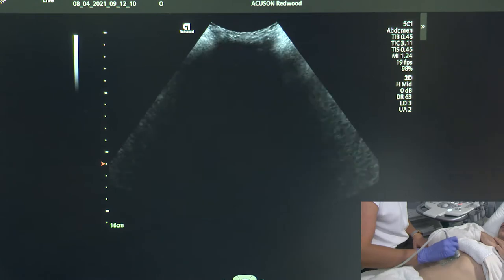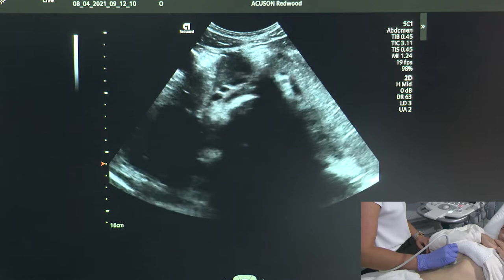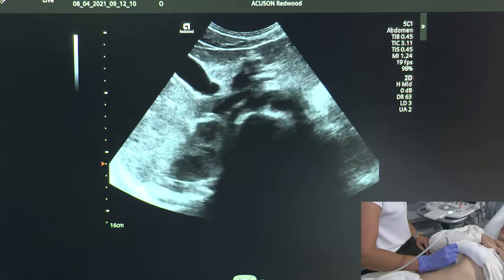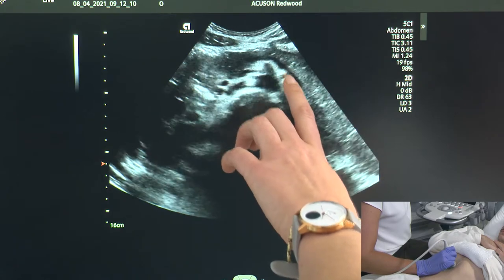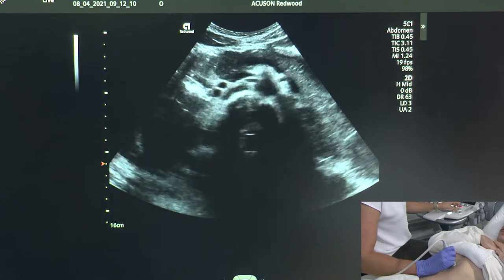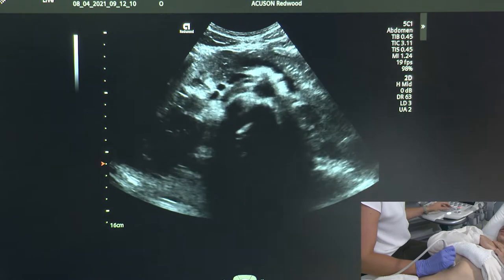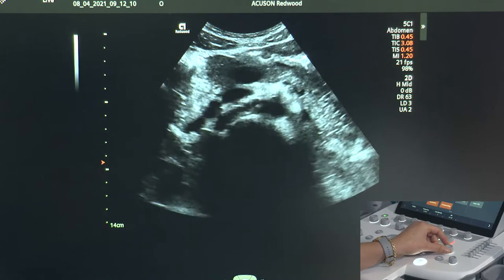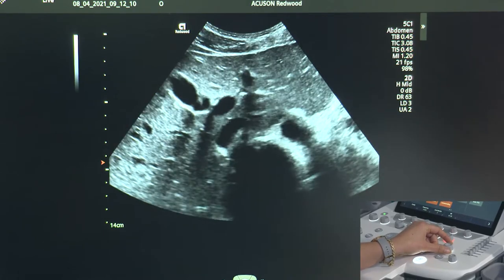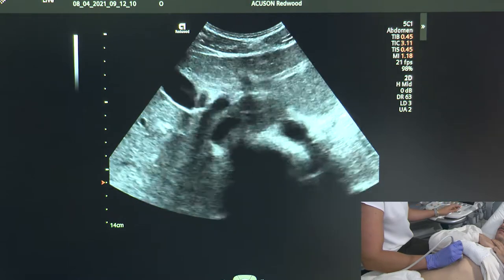We'll put the probe down and the first thing I want to do is try and identify the pancreas on my screen. Some of the landmarks I'm going to be looking for are the splenic vein and portal confluence. I can see the pancreas is now at the very anterior portion of my screen. Before I start scanning, I'm going to adjust my depth and focus to make sure it matches with what I am looking at.